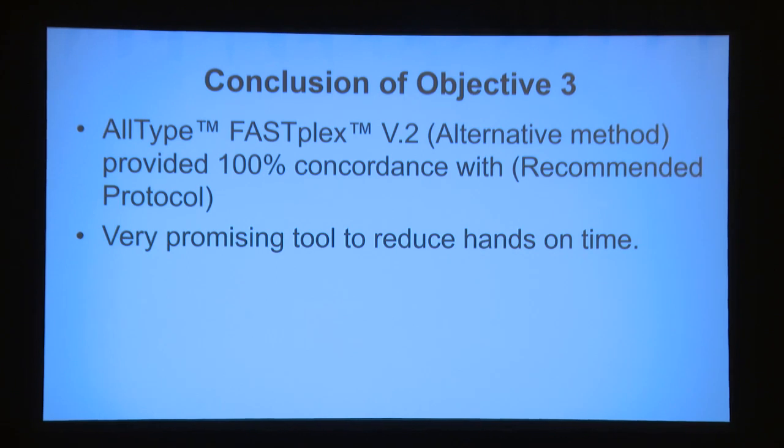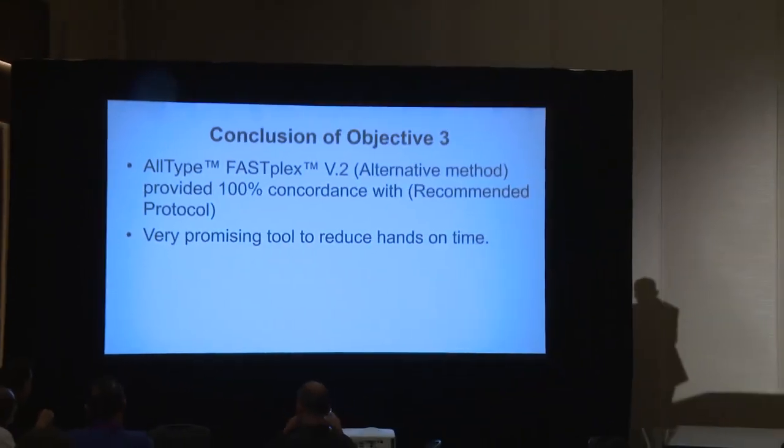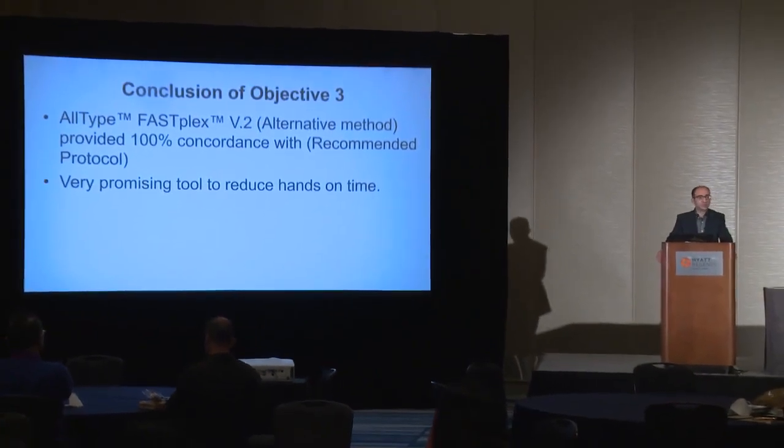So in conclusion of this objective 3, the AllType FASTplex version 2 alternative method provided 100% concordance with the recommended protocol. It's a very promising tool to reduce hands-on time, but some work is still needed to complete it and become clinically validated.